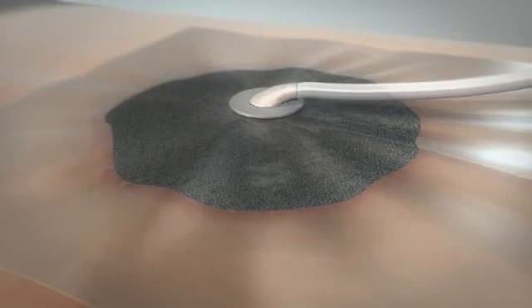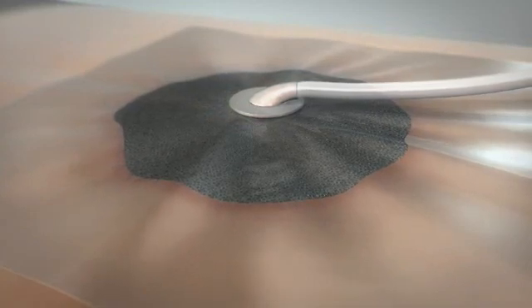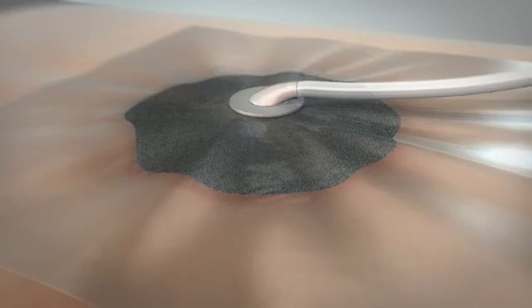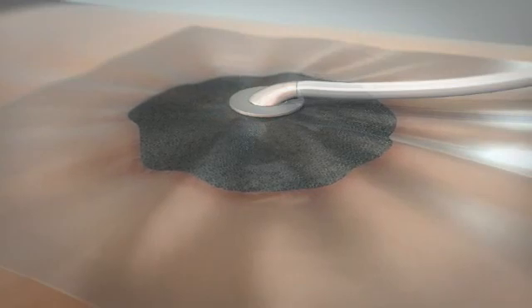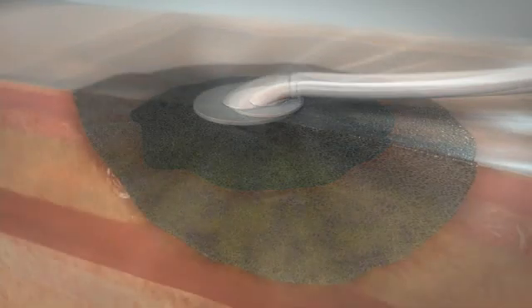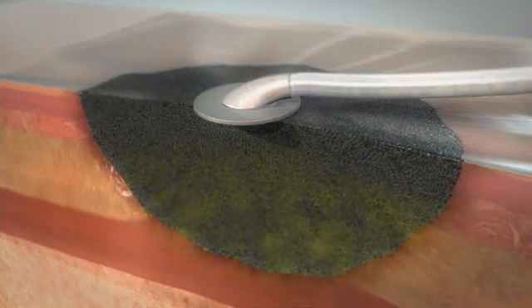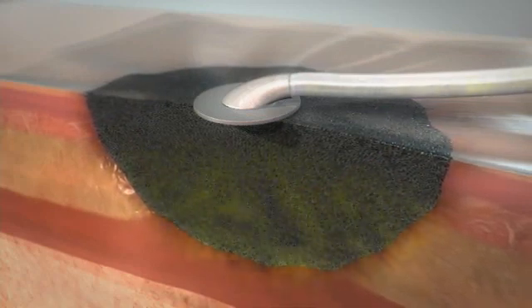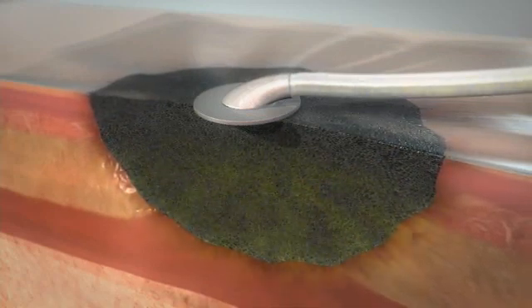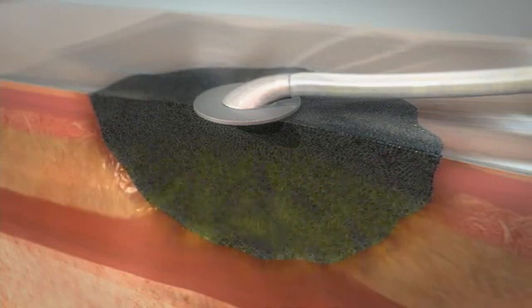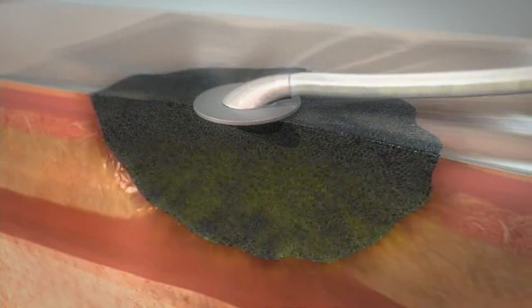Macrostrain is the physical response that can be seen immediately as the wound edges are drawn together. Other benefits include the reduction of wound volume, reduction of edema, the effective control of exudate, and the removal of infectious or inflammatory materials, including free radicals, which have been shown to impair wound healing.